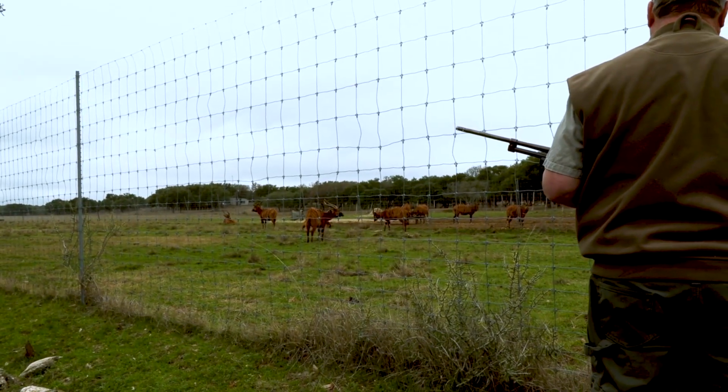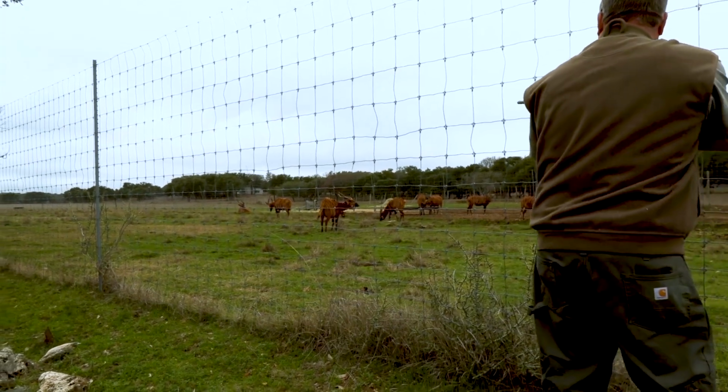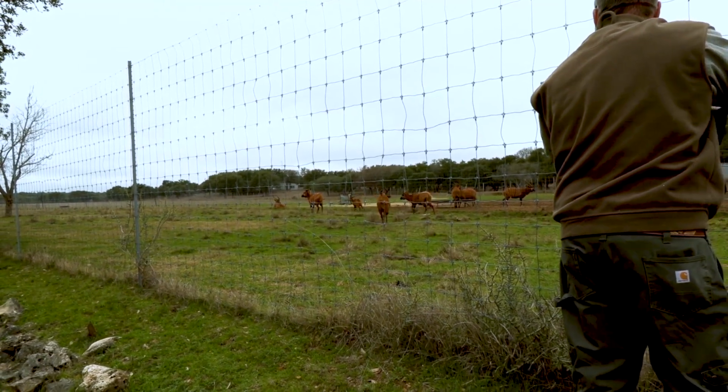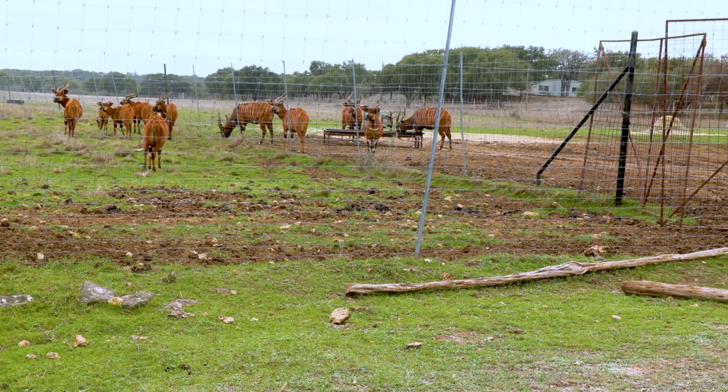Because I can't make her move and I'm not going to go in there, I am going to deliver it into her hip. Now, I know from experience it should take about 3 or 4 minutes to immobilize her, so we're going to go in there in a vehicle so we maintain safety amongst the herd.